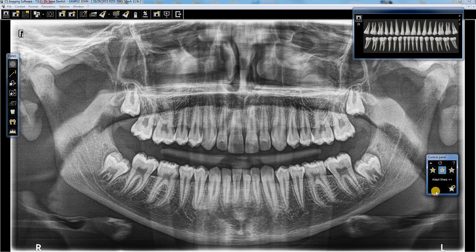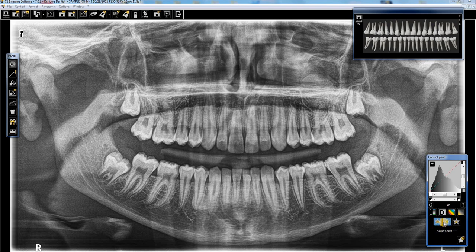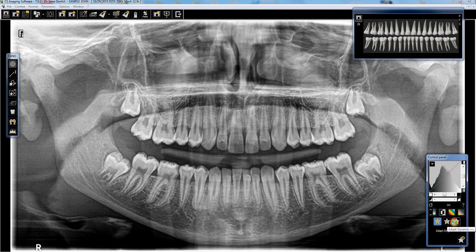Some of you guys might have this going on. Click on the up button — that'll bring up the full display. We should have a 0, 1, and 2 located. Those are our preset ADAPT filters, and I've got mine set up in a certain way.